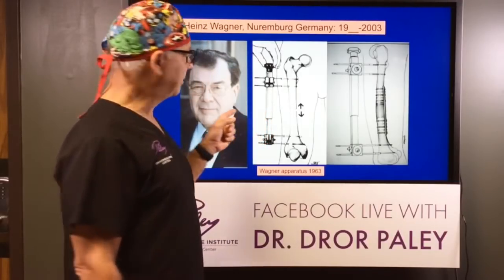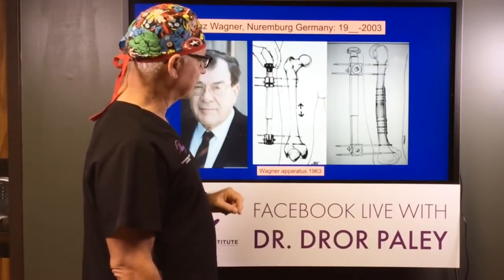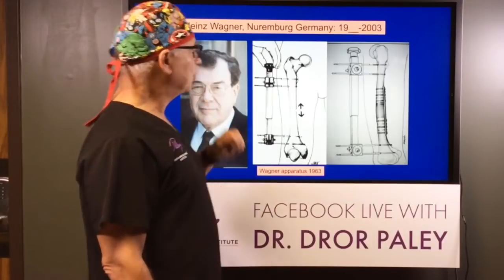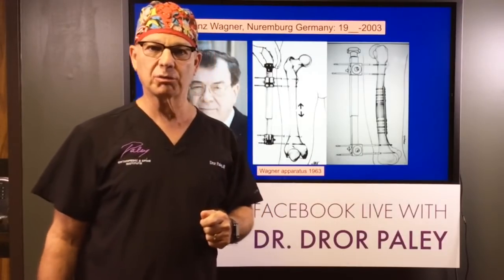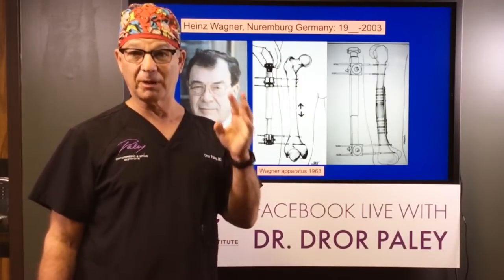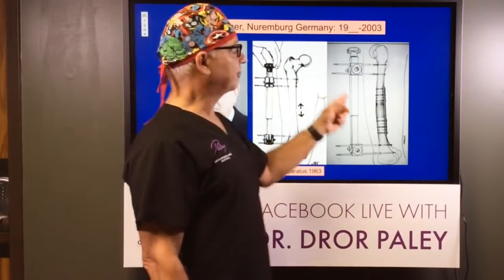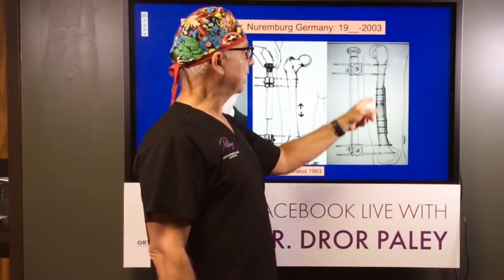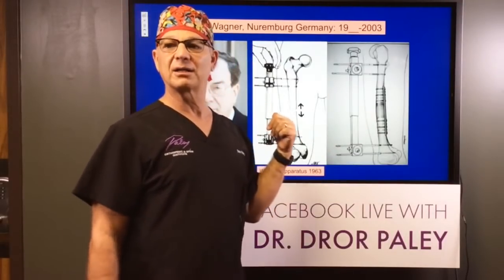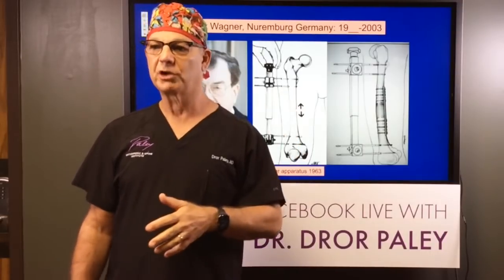You didn't have to lie in bed. You could have this external fixator. You could turn it with a nice little knob. Kind of looks like today's devices. And faster than the usual rate, which caused all kinds of problems, nerve problems, muscle problems, so on. And because he was going too fast, bone wouldn't form, so you'd have to put a metal plate and add bone graft to it. He set us back 20 years, maybe 30 years. All the knowledge that was known until the 1960s went out the window.